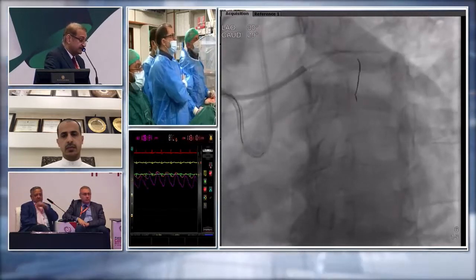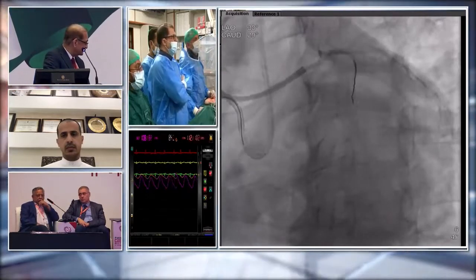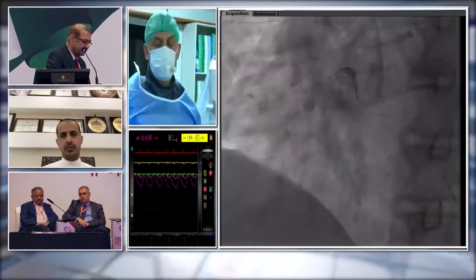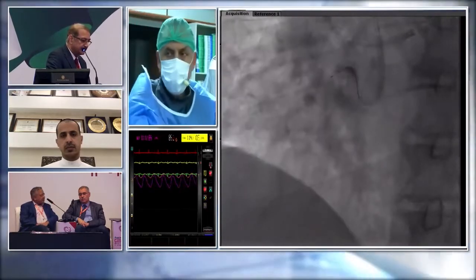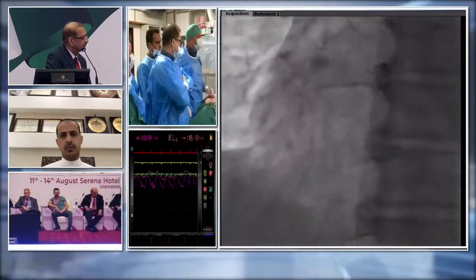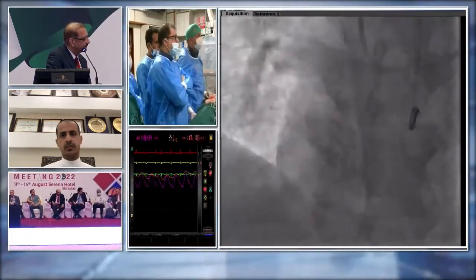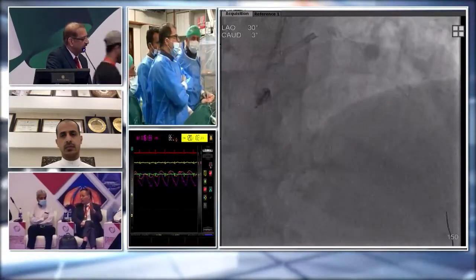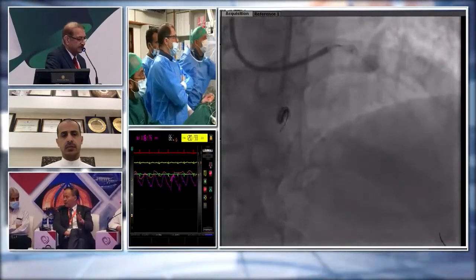Yeah, although there is some support from the right side in case. No, there's no support from the right side. Yeah, a little cross-filling we can see. Yeah, it looks like the right guiding catheter is sitting on the aortic valve too much. So I think the team should be very careful to monitor the hemodynamic change, particularly for patients with severe left main disease.